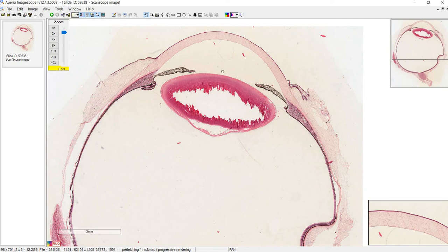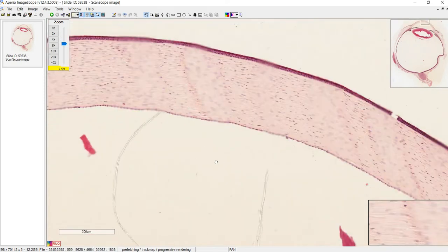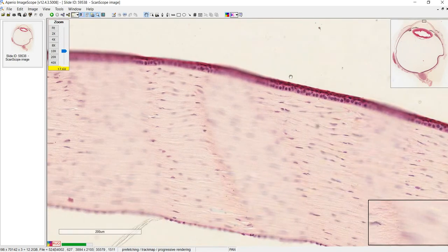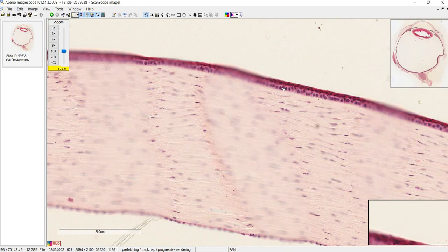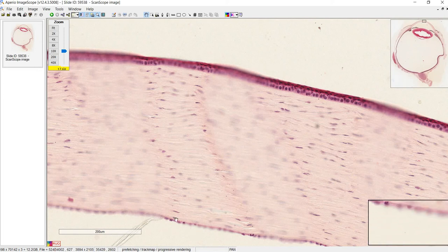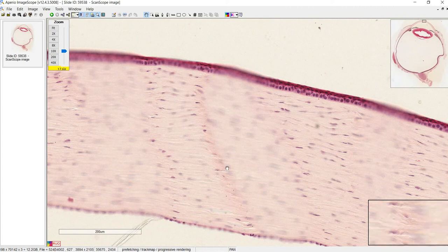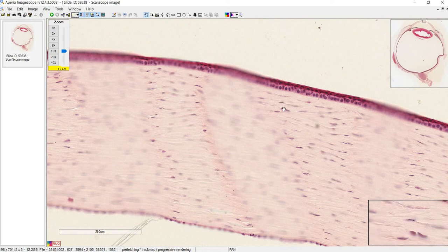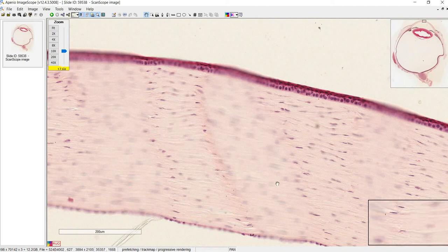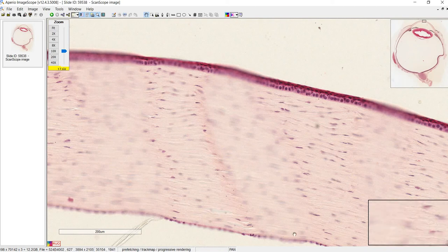Let's zoom into the cornea. The outermost structure is the corneal epithelium — a stratified squamous epithelium. On the inner end of the cornea is the corneal endothelium, which is simple cuboidal. Sandwiched in the middle we have a lot of collagen — all that wavy material — and those nuclei belong to cells similar to fibroblasts. The collagen and the corneal endothelium are derived from neural crest cells, which they love to test.